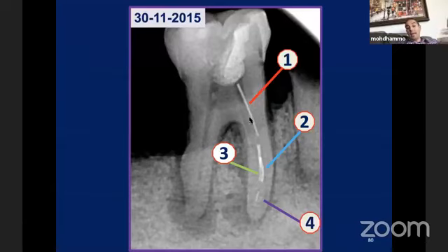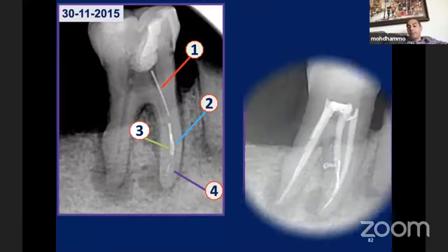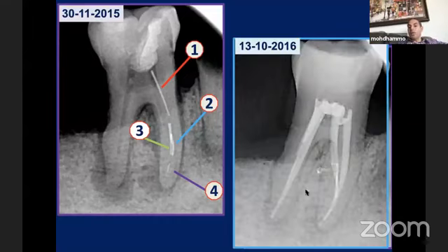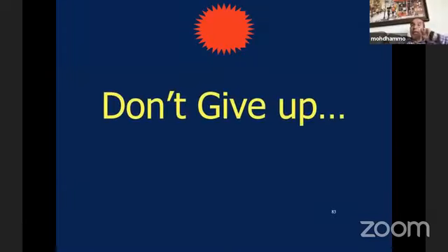As we said, we can remove it with an ultrasonic tip, but those parts I could not remove. I will bypass them, so you can see them here. And let's see this case after how many years? One year, you can see the healing. Let me show you the second advice. Please don't give up. Do your best and believe in yourself, because you can do this.